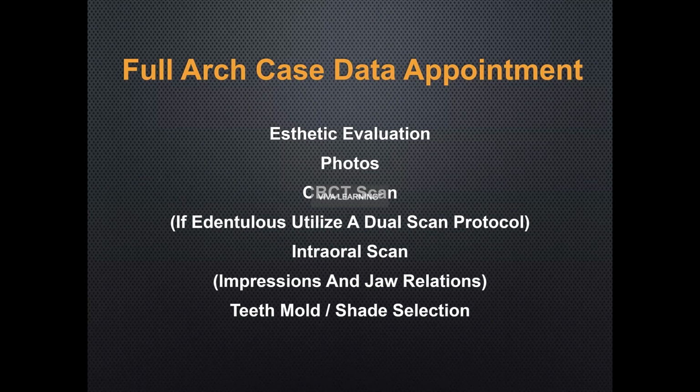And then real quickly before we finish up, I'll run you through a full arch case. Full arch case in my office, after the patient is pretty much satisfied with the treatment plan and accepted cost, then what we really need is one good 2-hour appointment to get a nice aesthetic evaluation.